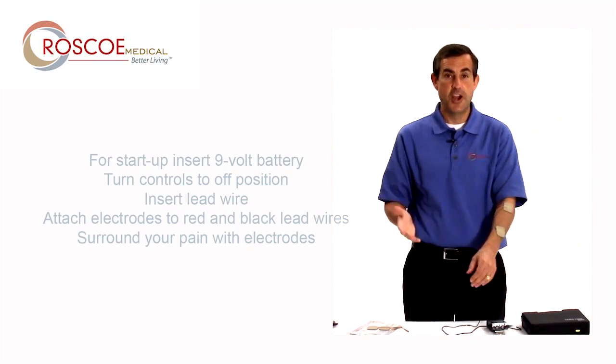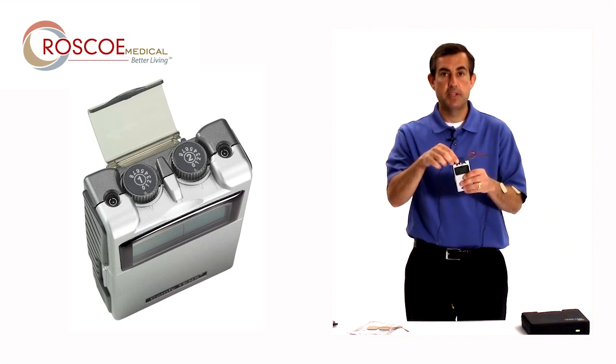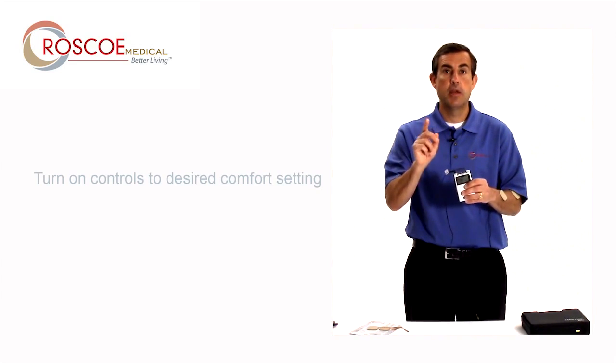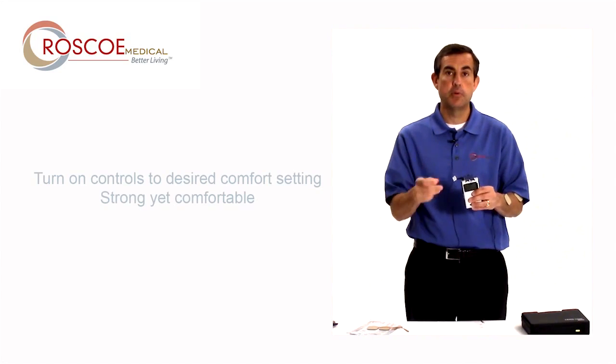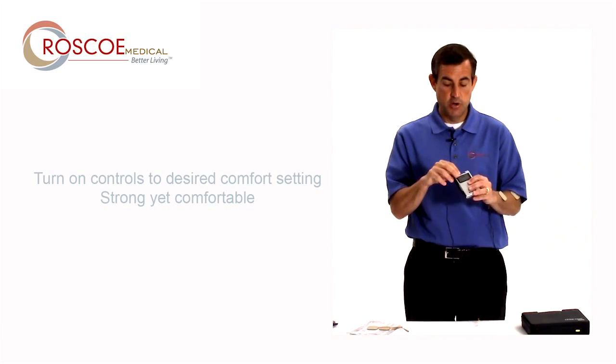Now that my electrodes are on, I simply take the unit and the knob that's by the channel I inserted and turn that up until it's strong but comfortable. I don't want it uncomfortable — I don't want it too strong, but it needs to be strong enough to help me out but not uncomfortable. So I turn it up.